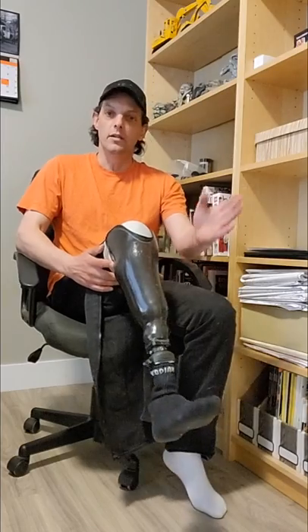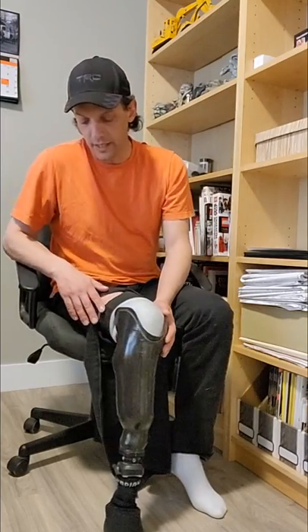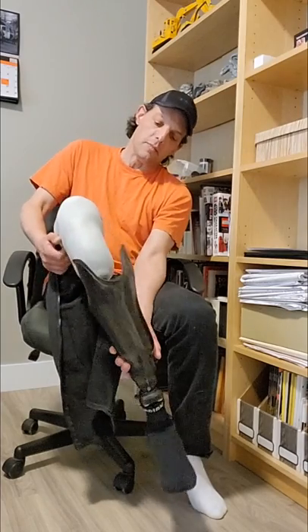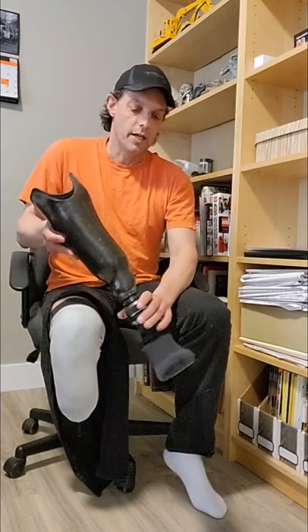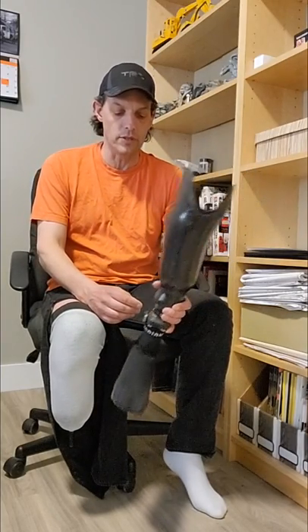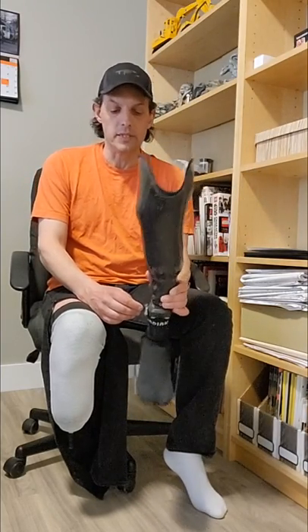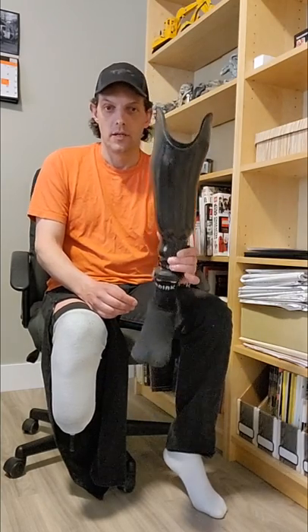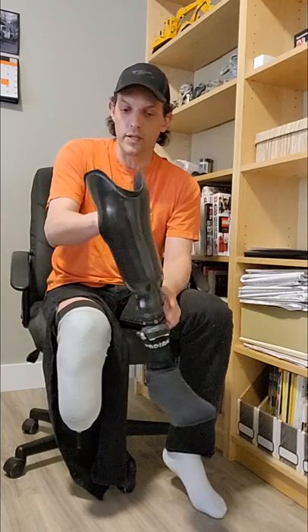I am now just over two years as an amputee and I'm still wearing a pinlock socket — for me it is my favorite. You'll hear a lot of people say that one system is better than the other, but I disagree. I think each system has strong points and weak points. For me, for simplicity, durability, and working construction, a pinlock socket is where it's at.